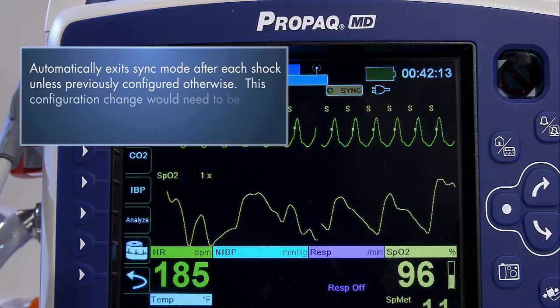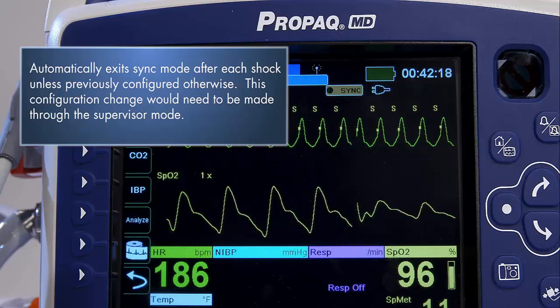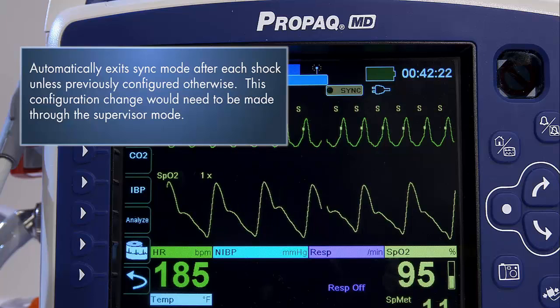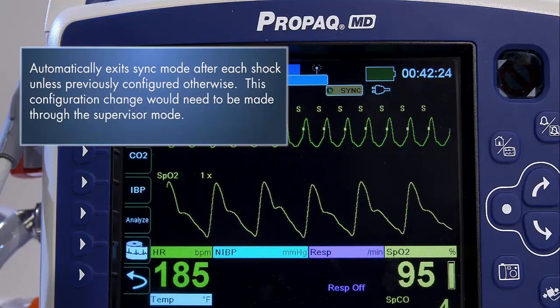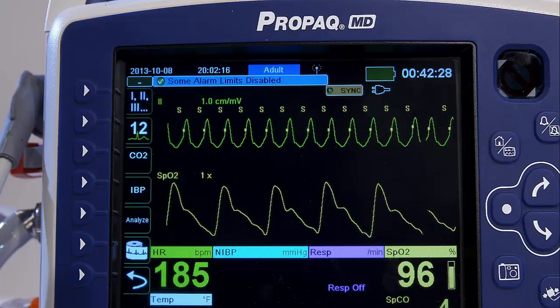It automatically exits Sync mode after each shock unless previously configured otherwise. This configuration change would need to be made through the Supervisor mode. Otherwise, you can reactivate Sync mode by pressing the button again.